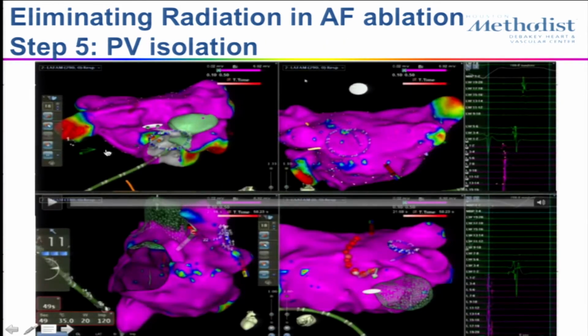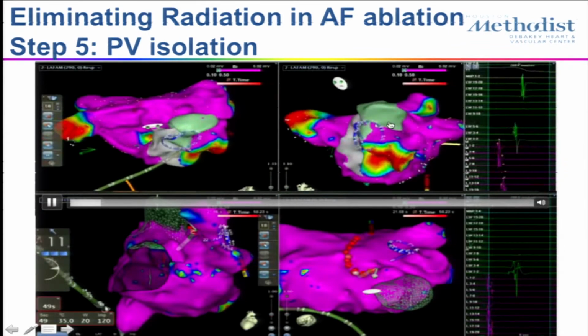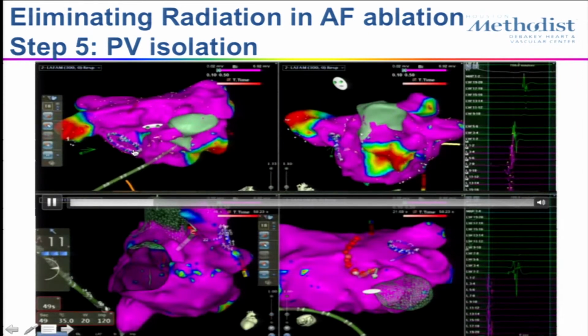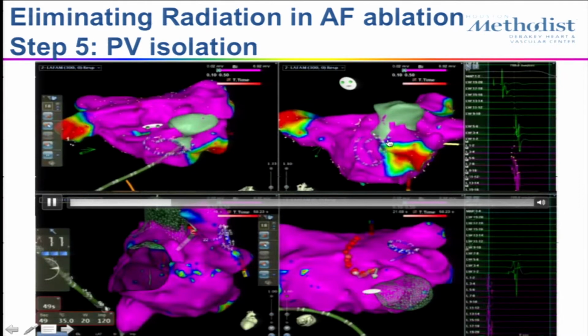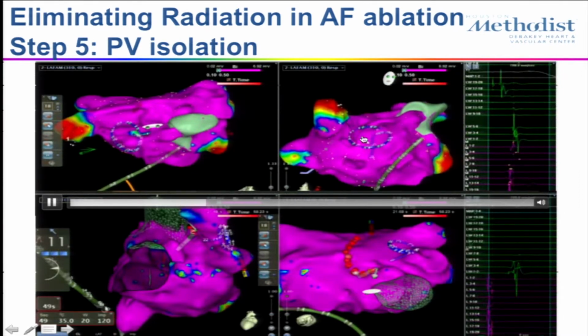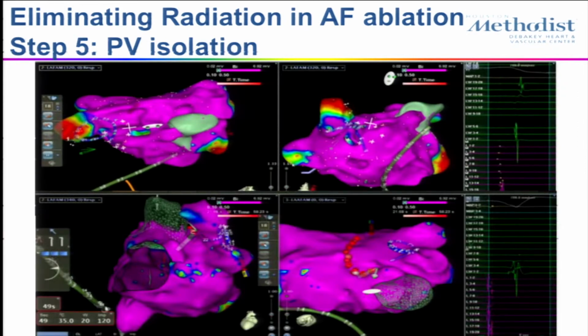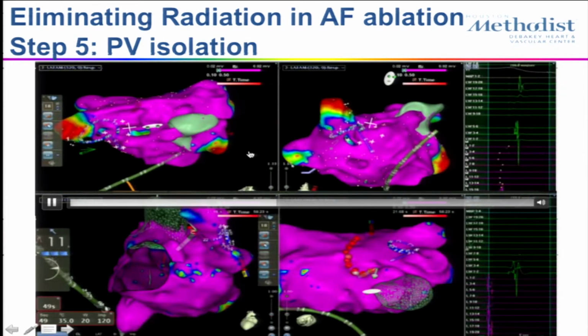So then I've completed a geometry of the left atrium, and then I start working with the ablation. So you're going to see me now, this is the circular catheter. I guess I'm completing the geometry here. I have a gap here. You see a hollow spot, you need to get your catheter there and get signals and complete it so that I don't have a hollow spot in the septum. The beauty of this is that the technician, once they get trained, they follow the procedure with us and they can move and optimize the location of the views and the angles to what we're doing.